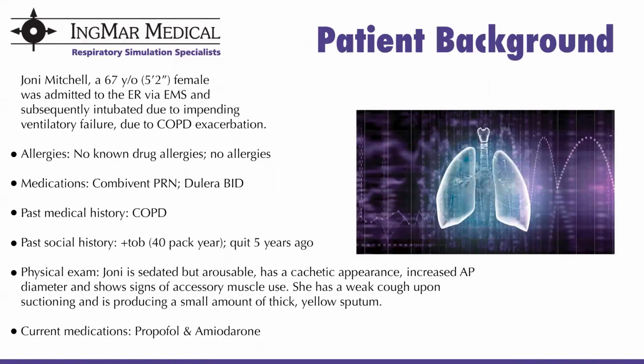Today, we will be demonstrating one of 4 stages within our Trigger to Synchrony curriculum module. Typically, our scenarios take the same initial patient through different stages, each presenting the student with a specific problem to resolve.